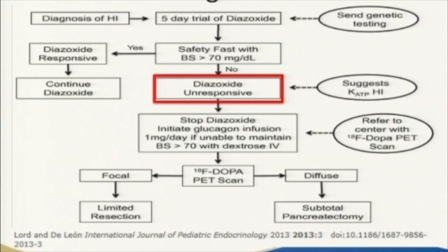Okay, so it's really for finding that lesion, finding exactly where it is. So it's a shorter surgery. Dr. Adzik knows where to start. And that is the real key role in using this PET scan.